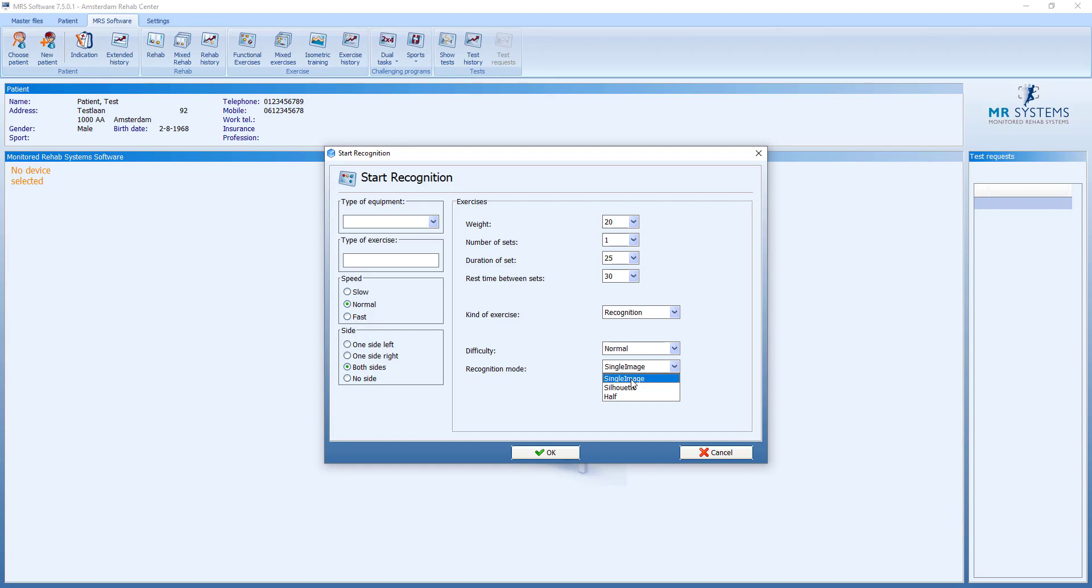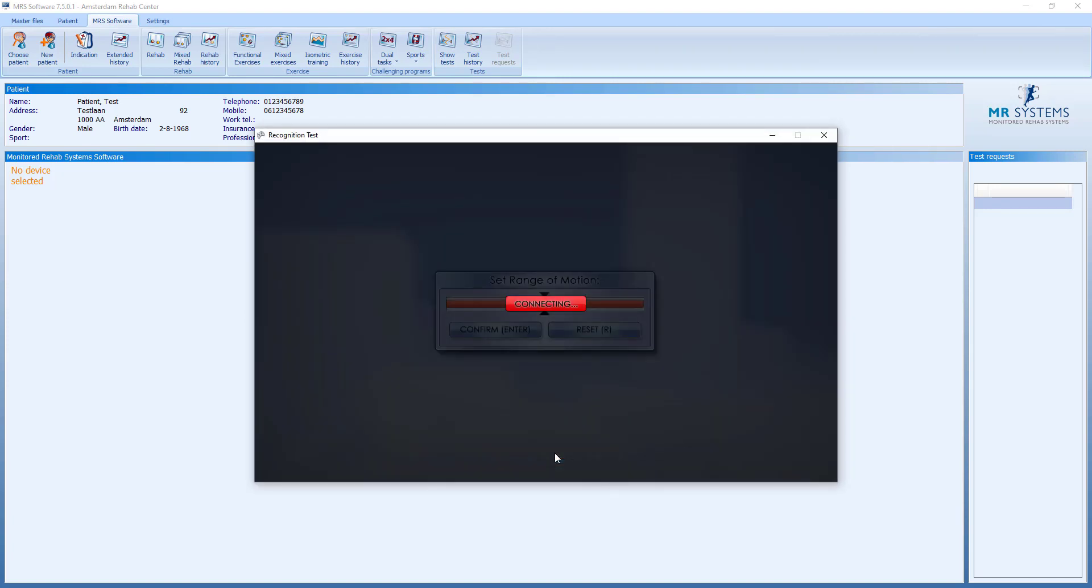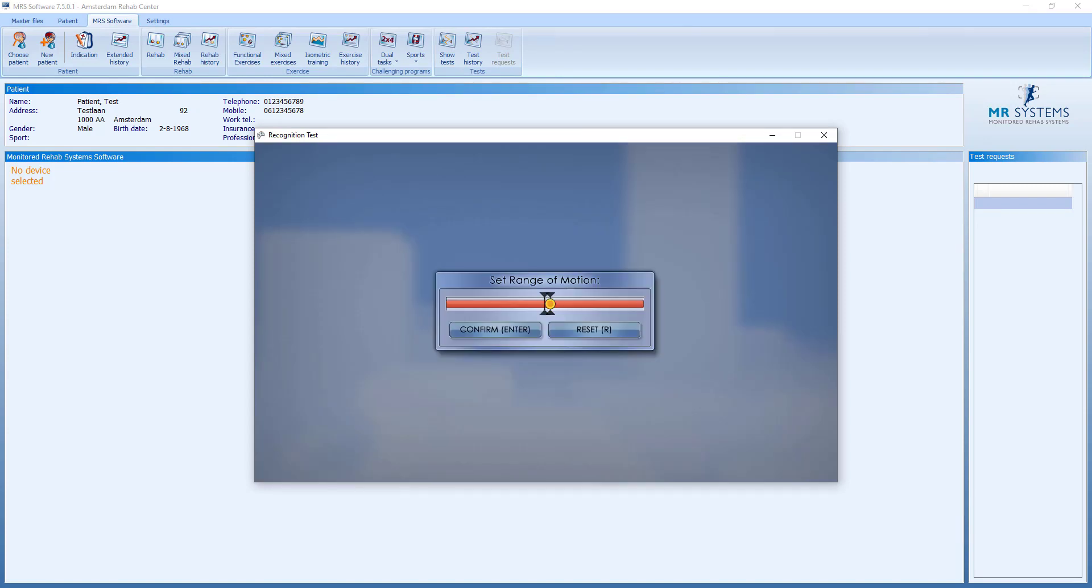We have three different modes where we can play with. If we choose a single image, we ask the patient to do one repetition to set the range of motion.